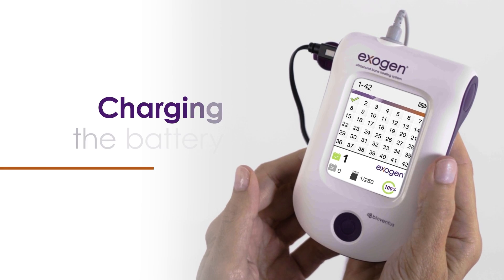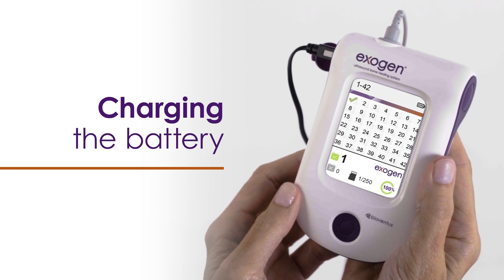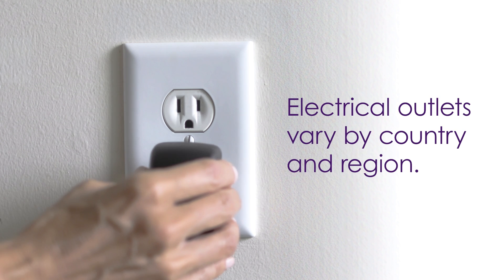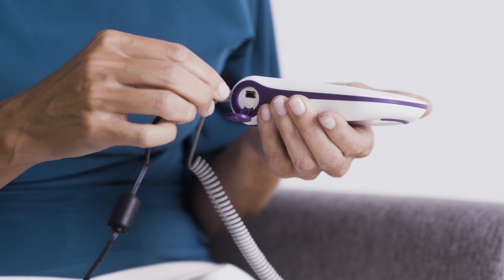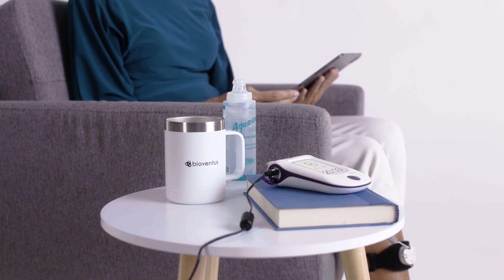Your Exogen device will arrive partly charged. However, it is recommended that you fully charge the device before beginning treatment. To recharge the battery, plug the charger into an outlet. Open the cover of the USB port on the left side of your device and insert the USB portion of the charger into the device. The flashing battery status symbol will let you know the device is charging. Charge the battery until the symbol appears full. This will give you enough power for approximately five 20-minute treatments. You may recharge the device at your convenience, even during an Exogen treatment.